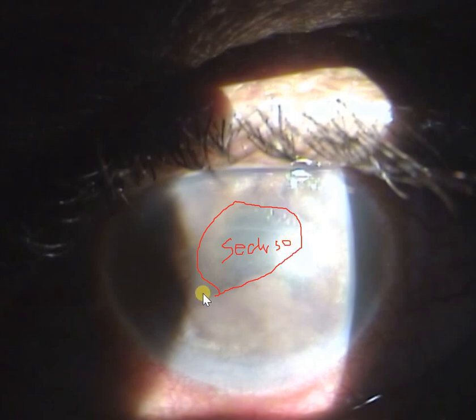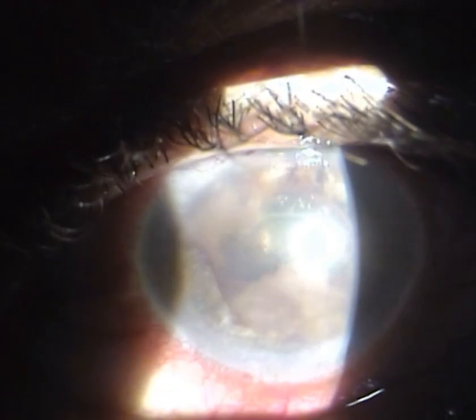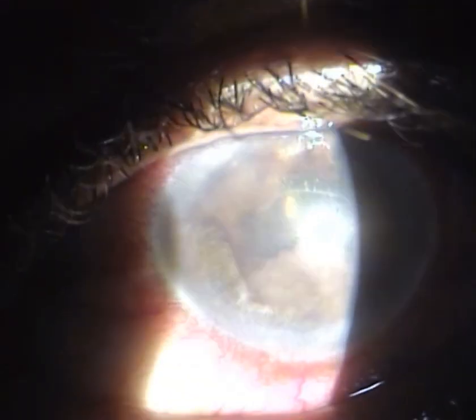And if the similar thing was happening, that there was a dense pupillary membrane covering this area and occluding the pupil, that would be called occlusio pupillae. So this patient has got a seclusio pupillae compared to an occlusio pupillae, which we can see in patients. And the next thing which you see over here is, I'll just move the video slightly forward or backward, and you can have a better view of this area.